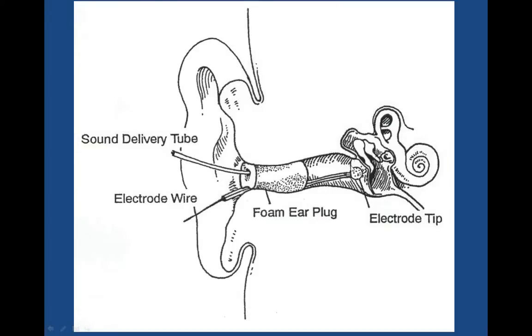Every now and then, if we hit the annular ligament of the eardrum or the person has an extremely sensitive ear canal, they may report some discomfort. But in the years I've been doing this, I've never had anybody say, this is so painful, I can't stand it, because it really is a fairly non-invasive, fairly painless approach. Once we have the electrode resting on the tympanic membrane, and I'm to a point now where I don't use an otoscope other than to look into the ear beforehand to make sure I've got a clear path to the eardrum. It's very difficult to use an otoscope and then insert the electrode and verify its contact on the tympanic membrane because it's pretty big.